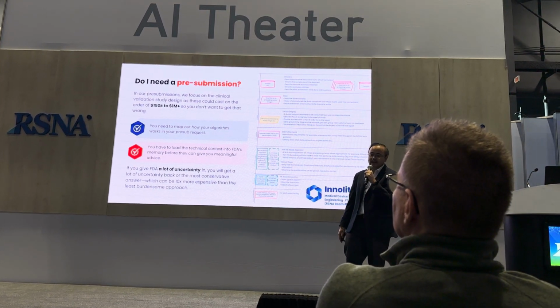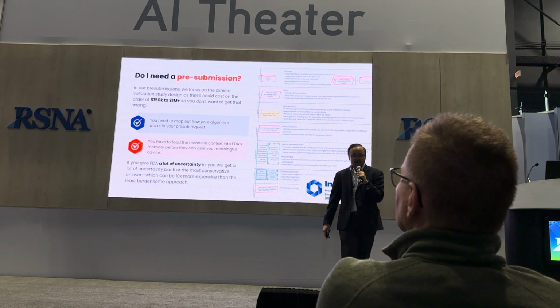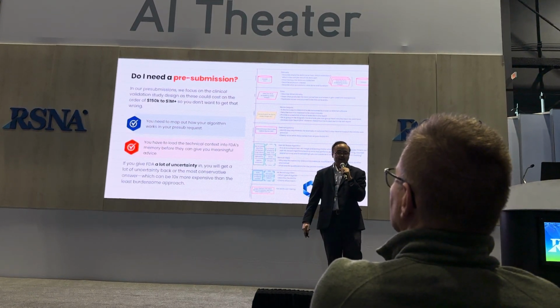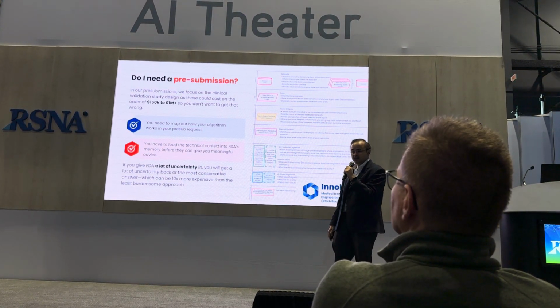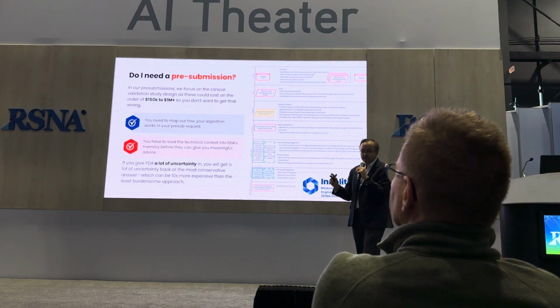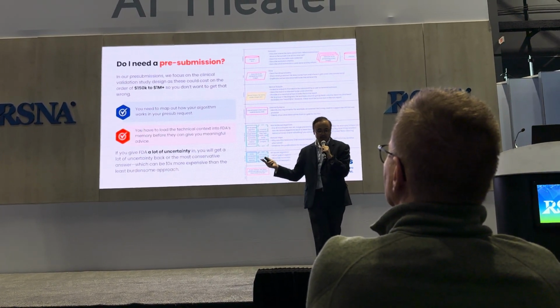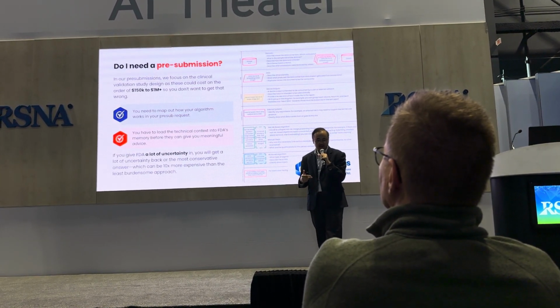It's important to communicate your algorithm design to FDA. FDA is very technical. They want to know how the algorithm works, they want to know all the steps involved, and they want to know the failure modes. So let's make their life easier by breaking out into different categories. And here's a block diagram key that we've developed. You can also look at more of this on our website.